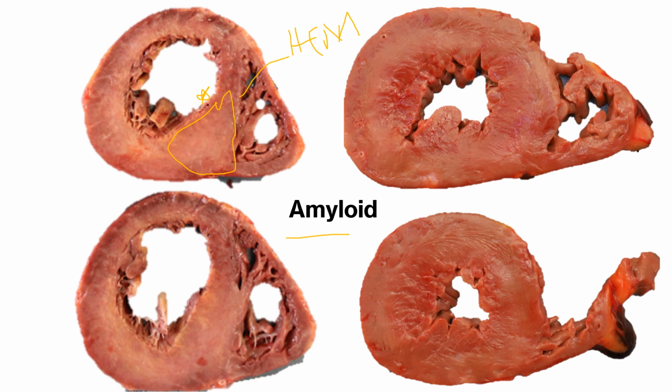This patient was much younger. This was a case of senile amyloidosis and looks pretty normal. But on every microscopic section, there was diffuse amyloid everywhere. So just be aware of the different presentations that this disease process can have.